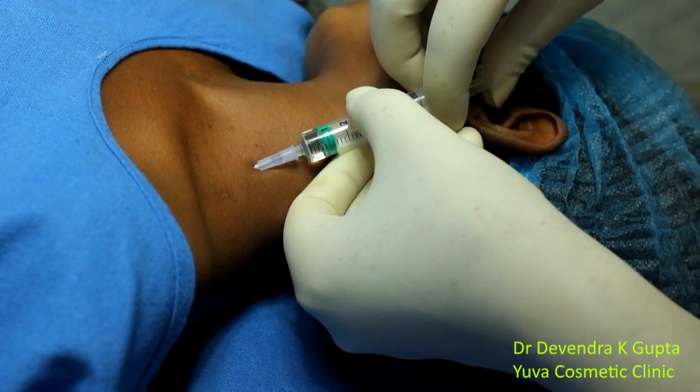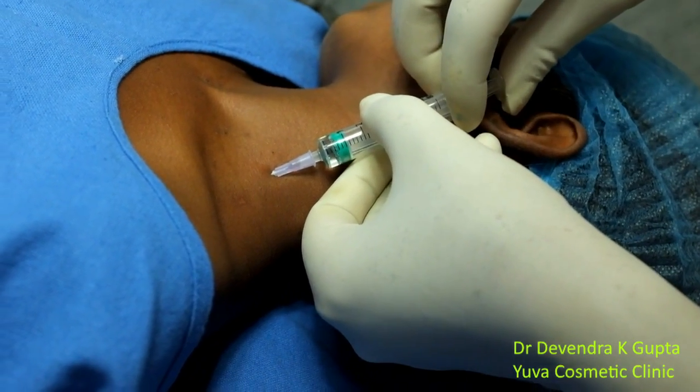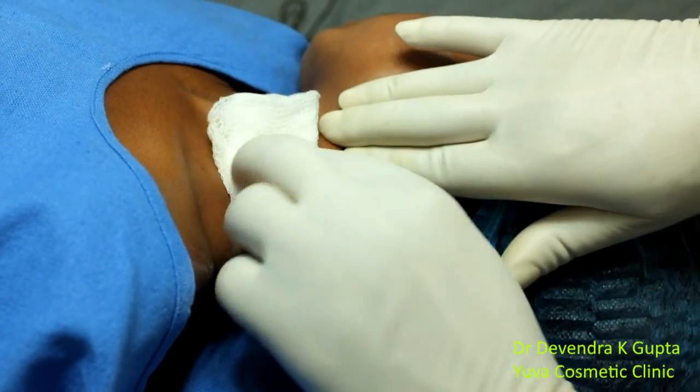I am planning to give 10 ml to this 11-year-old child. Then apply pressure in an upward direction and massage.